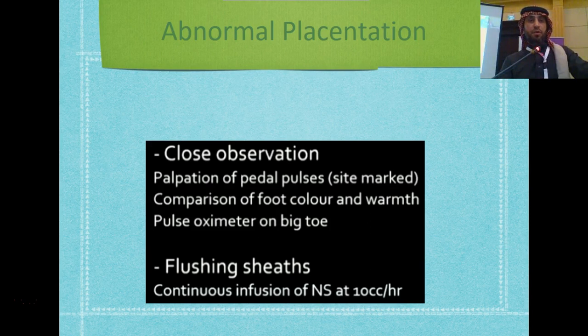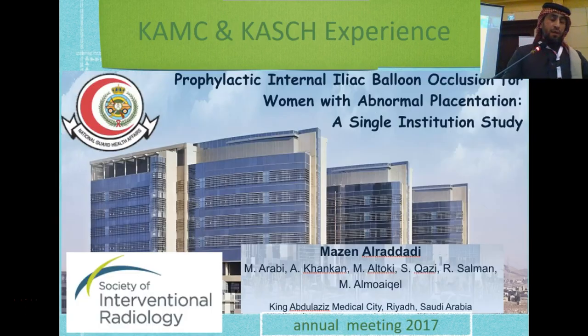Flushing the sheath is very important, and we try to endorse to the nursing side how to flush and how to use the sheath. Usually we finish the procedure and then it's deflated, so we don't use the balloon unless it's after delivery of the baby.